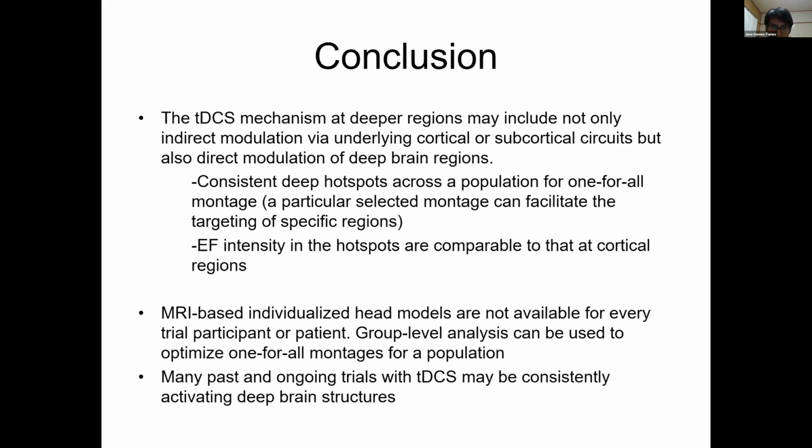So this group level analysis can be used to optimize a one-for-all montage for a population without MRI-based individualized head models. This may reduce time, and may also reduce equipment allocation for large trials.